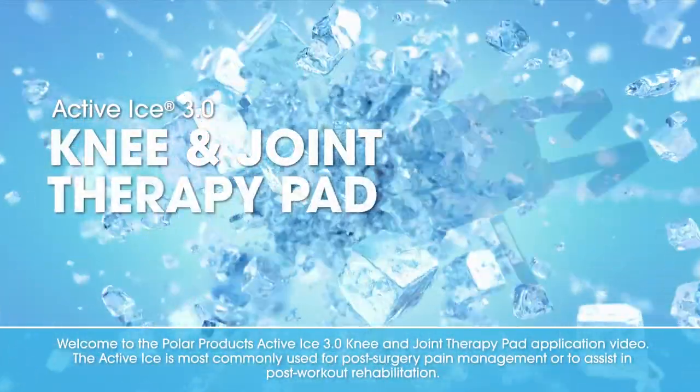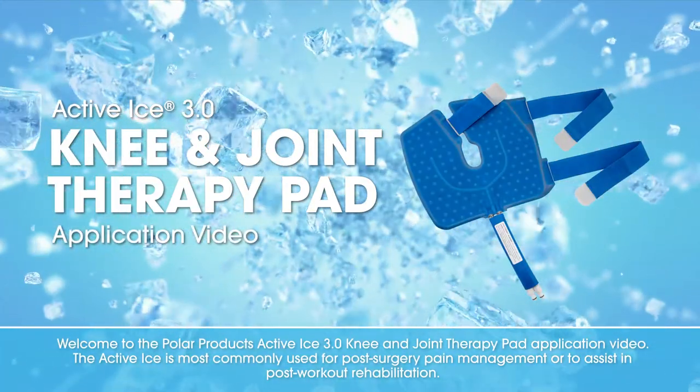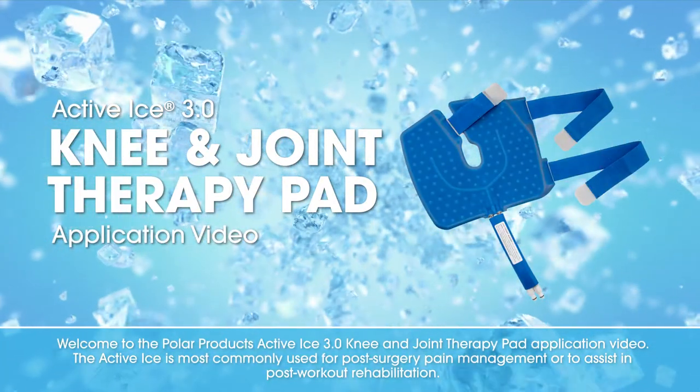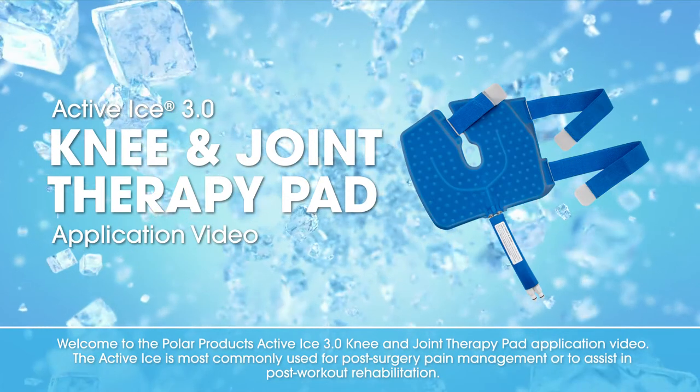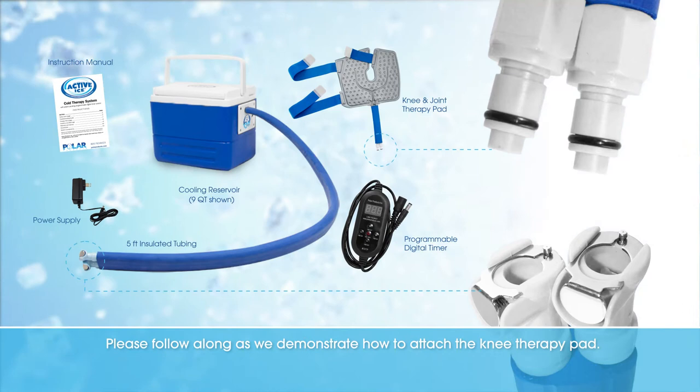Welcome to the Polar Products Active Ice 3.0 Knee and Joint Therapy Pad application video. The Active Ice is most commonly used for post-surgery pain management or to assist in post-workout rehabilitation.